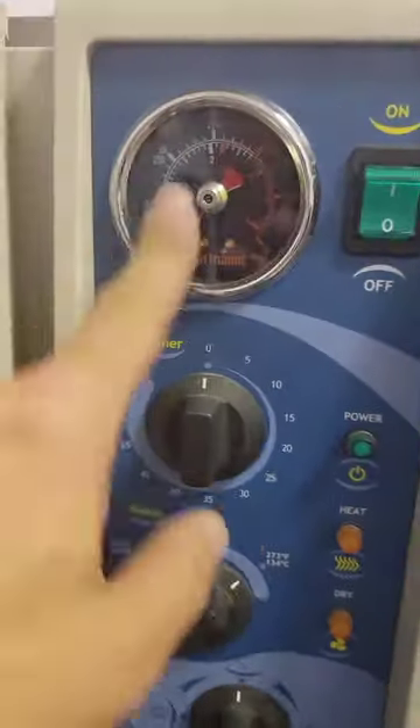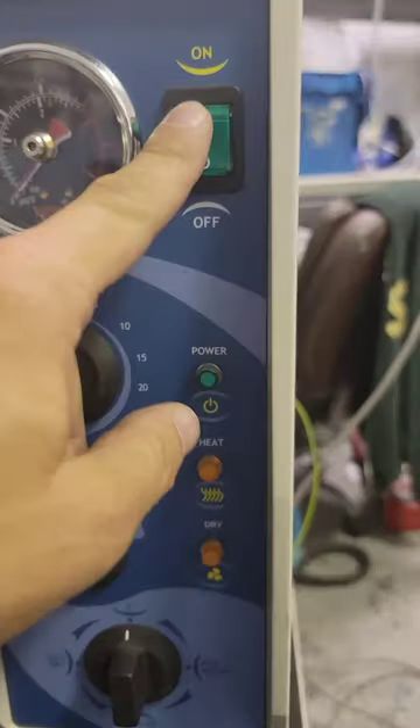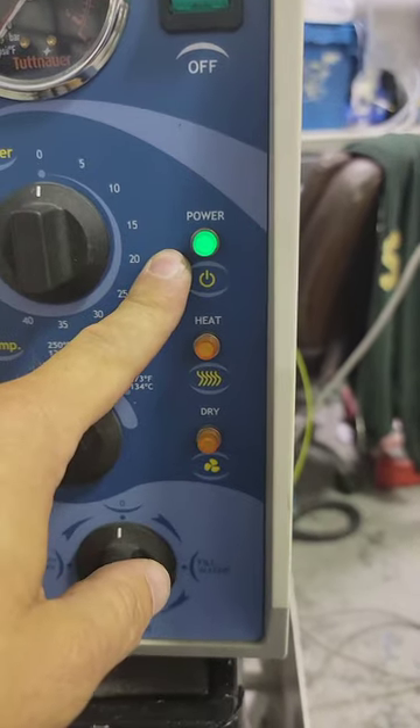There's all our knobs. Speed, no pressure. Timer's down, turn to the off position. Power it up. Light — power. We have power.